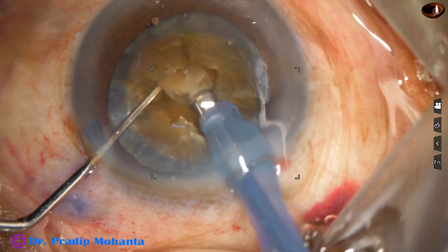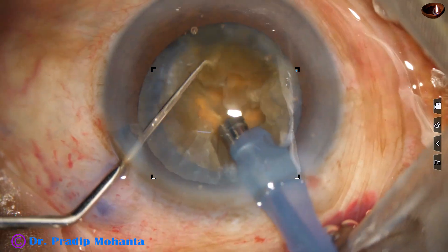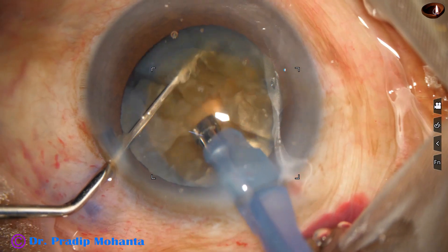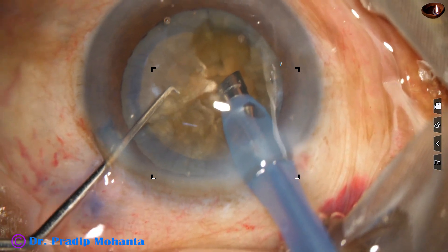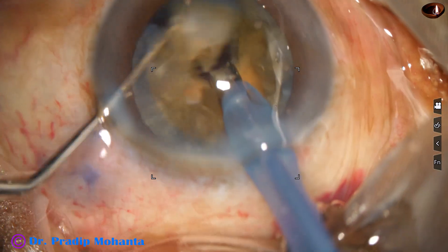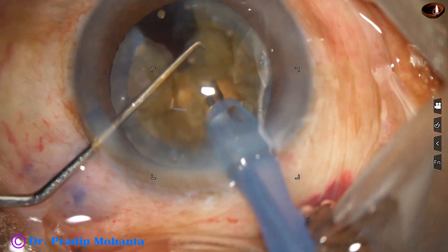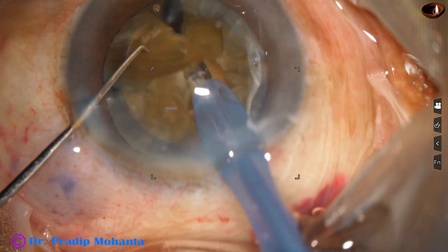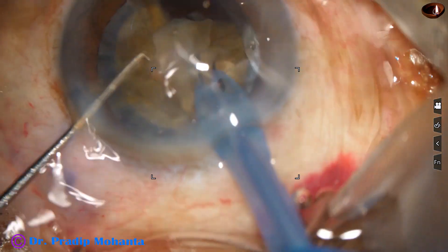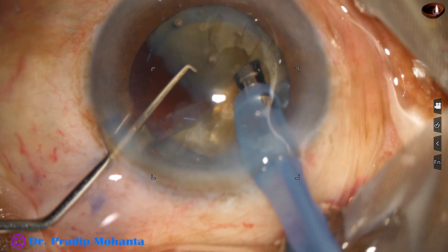Emulsify the endonucleus and start chopping the larger fragments. As we start chopping the larger fragments, we will get some free pieces, and we can start emulsifying from those free pieces. From the beginning, vacuum is 450 mmHg, ultrasonic energy is 85%, flow rate is 45 ml per minute. We have emulsified almost one quarter of the nucleus.